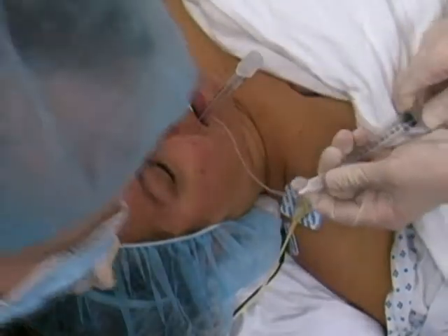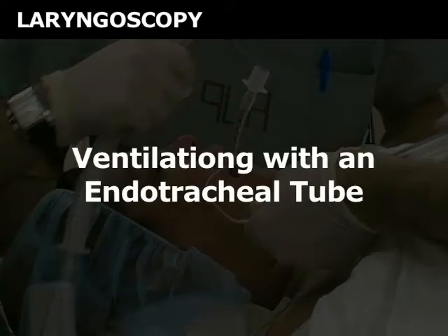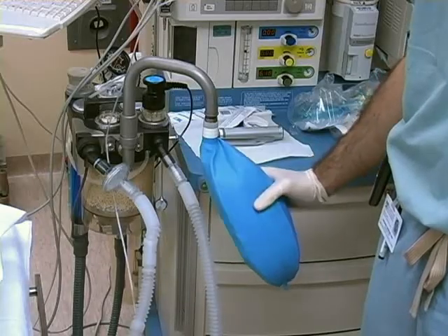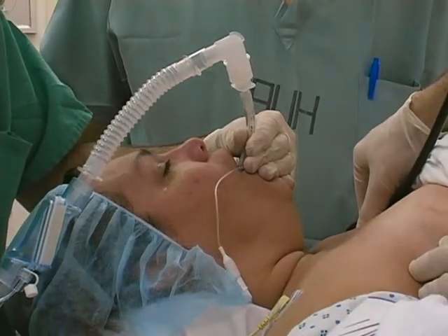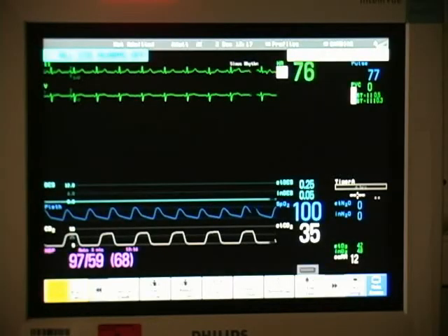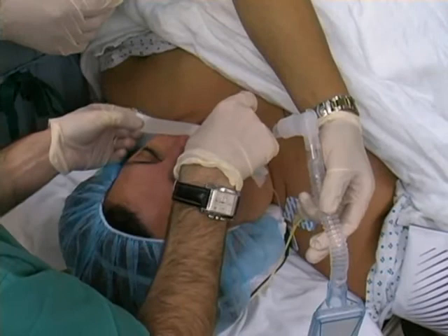Carefully remove the blade. Inflate the cuff of the endotracheal tube with a clean syringe using the minimum volume of air needed to prevent a leak. Connect the endotracheal tube to the breathing circuit. Provide a gentle breath with the reservoir bag, not to exceed 25 centimeters of water pressure. Confirm successful ventilation by watching for chest rise and auscultating the lungs bilaterally. Verify ventilation by checking the monitor for the presence of end-tidal carbon dioxide. Remove the dental guard and inspect the teeth for incidental damage.